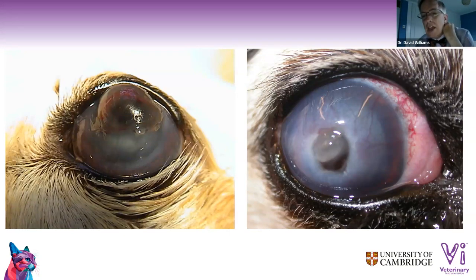So the thing is, when you've got something like a perforated corneal ulcer, I have done hood grafts on those, and they really work really well, and they're easy to use. You don't need amniotic membrane or anything like that. I know people have tried lots of things, and none of them really worked well. So I must admit, the hood graft has worked really well.